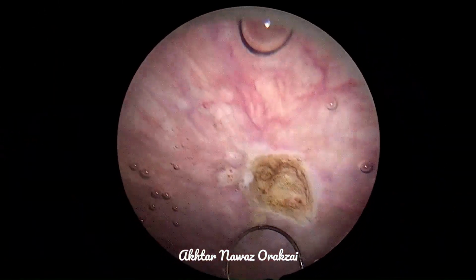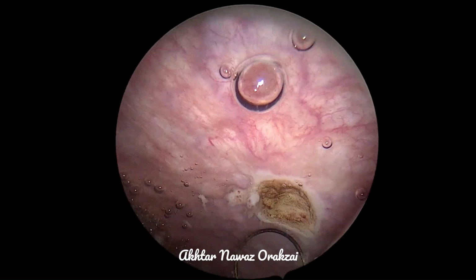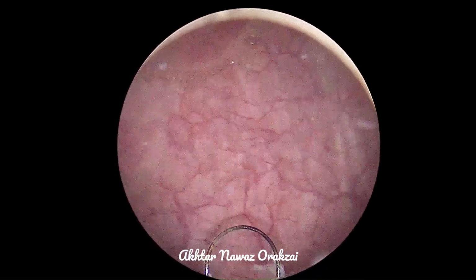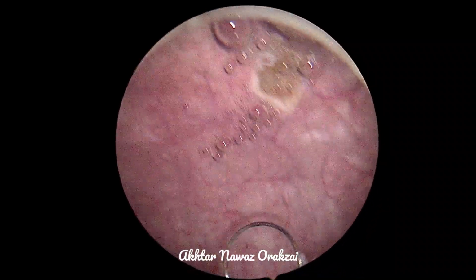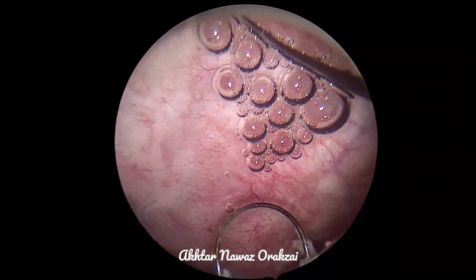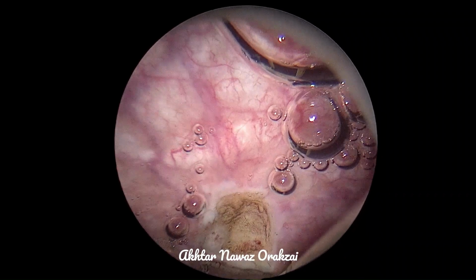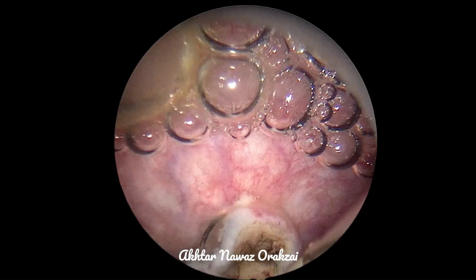However, you need to be quite away. So here we have resected that mass, and now we are taking deeper tissue in the resection so as to get muscles as well. Here you can see, this is the deep tissue.